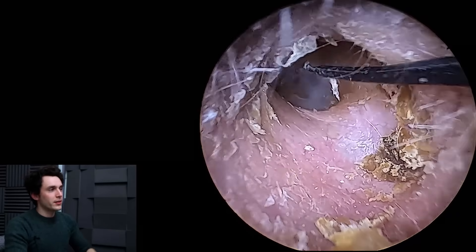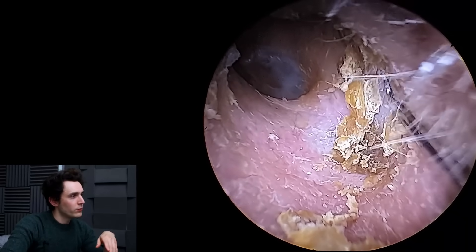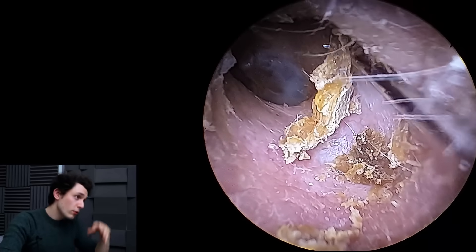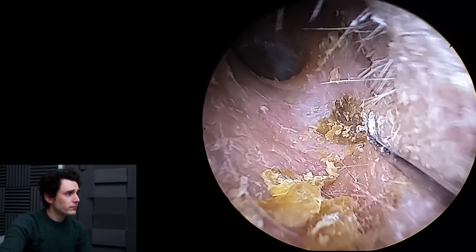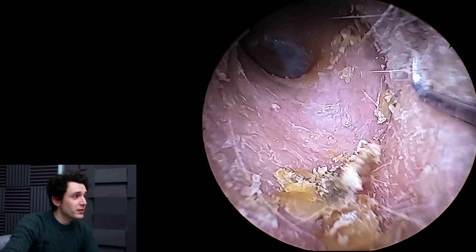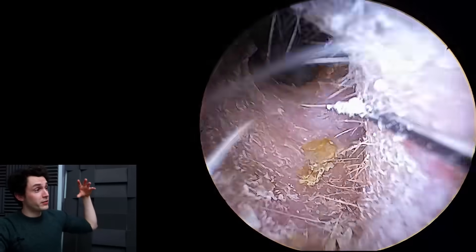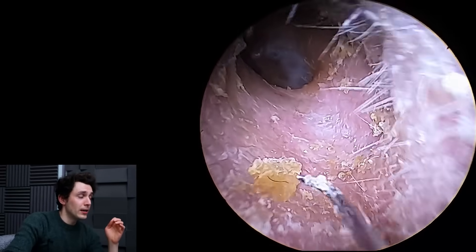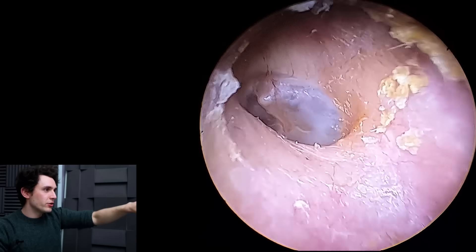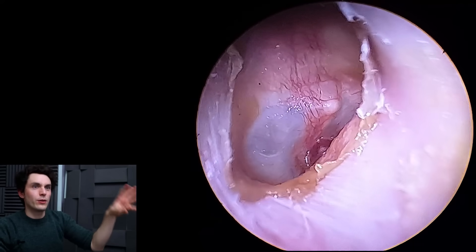You can see the eardrum in the background — it's that lovely kind of bluish-gray color. We'll just tidy this up with a Cawthorn hook, which is a fantastic tool. If any audiologists out there are wanting to work with a micro hook, Cawthorn number six is absolutely the best. Is the patient feeling any better now? Yes, he's feeling much better, but the tinnitus still bothers him quite profusely. I don't think the long-term tinnitus was anything to do with the bleb — he has it in the other ear as well. I think the tinnitus is being caused by the underlying hearing loss that he had anyway.